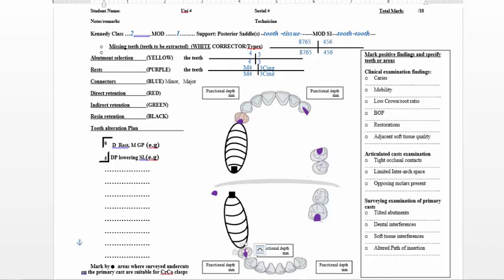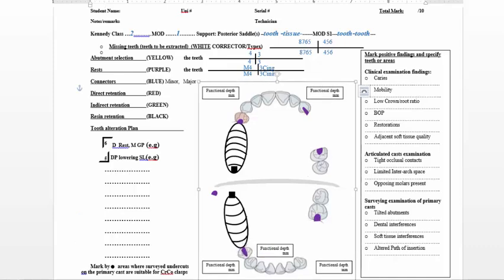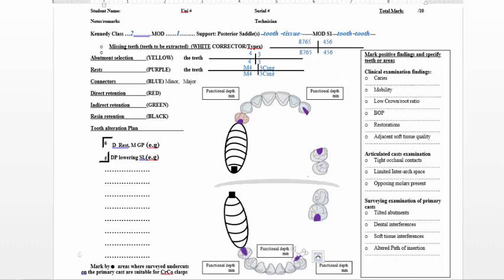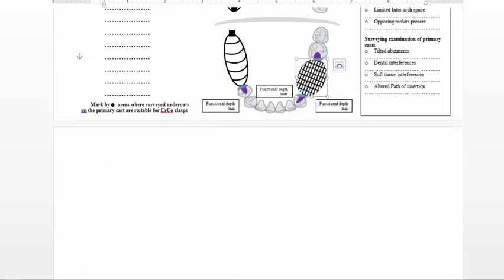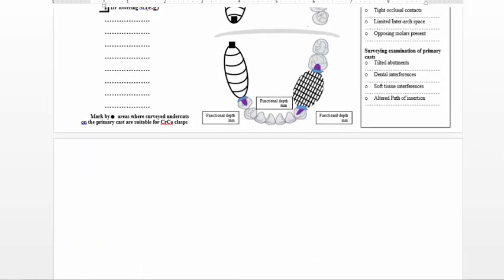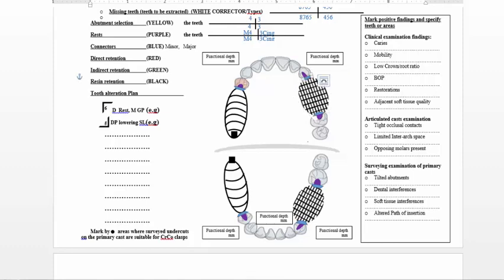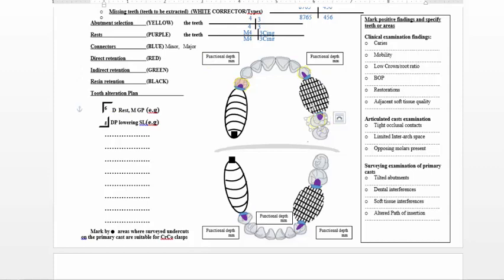We add rests depending on the tooth type. For anterior teeth, we use cingulum rests. After the rests, we add the minor connectors — specifically the guide plates — which are close to the guide planes on proximal surfaces, placed around all teeth adjacent to a saddle area. We then finalize the saddle areas with a mesh. For bounded areas, using a mesh versus an open lattice has specific indications and contraindications that you should review in your theory. The abutment teeth checked clinically are colored in yellow to verify suitability for support.